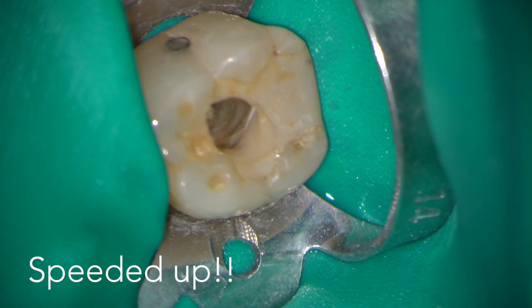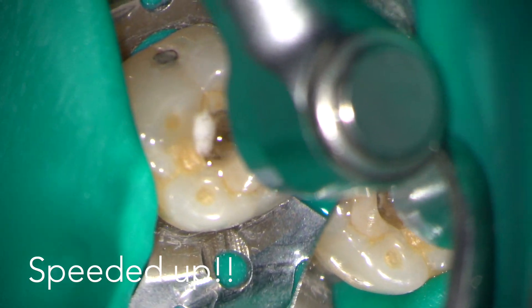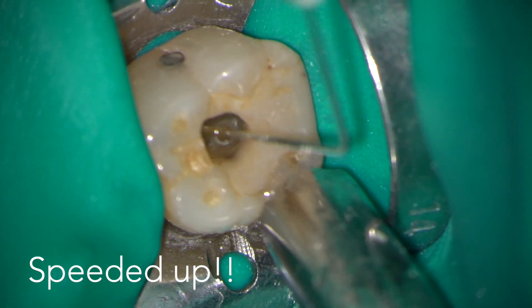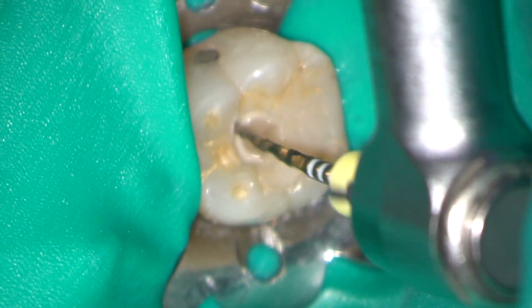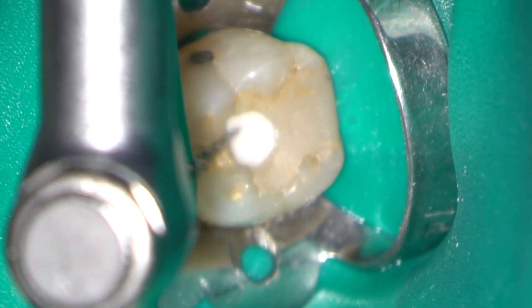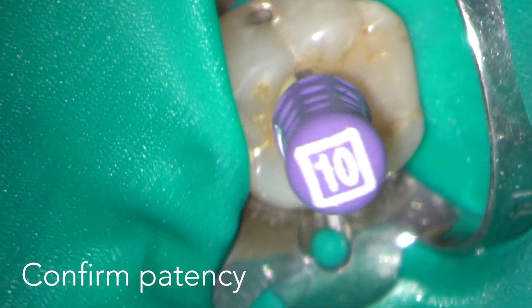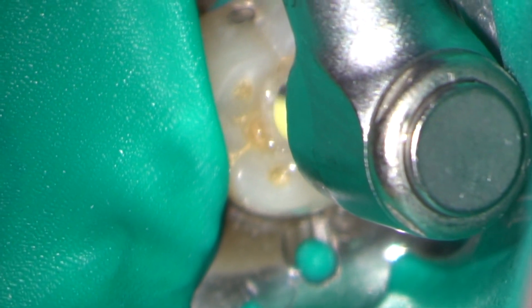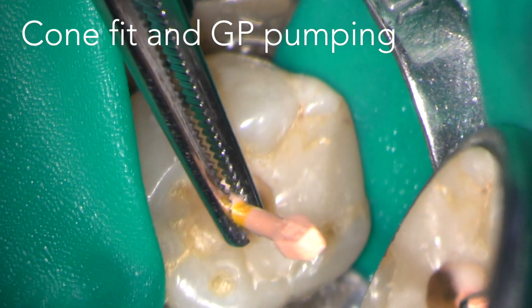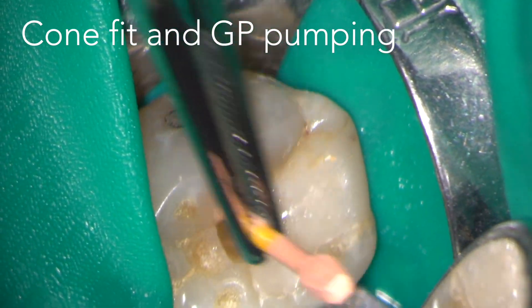The next section showing length estimation and preparation has been speeded up. In a case like this, where the canals are quite sclerosed, it's important to use plenty of irrigant and keep going back with a small hand file to confirm patency. Here I'm combining the cone fit with some GP pumping. GP pumping is a very effective way of agitating the irrigant in the root canals when they've been prepared.